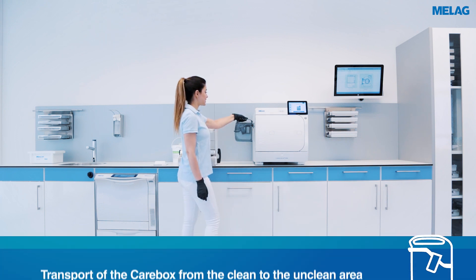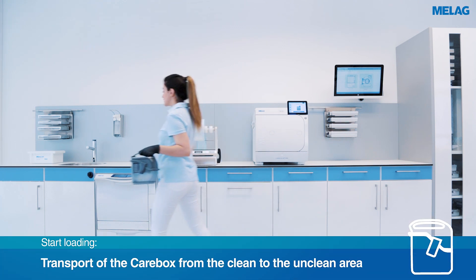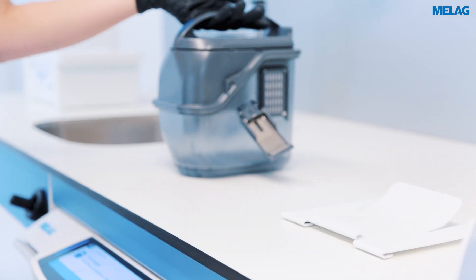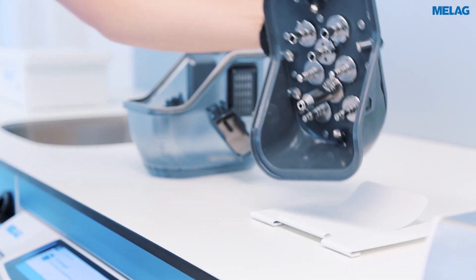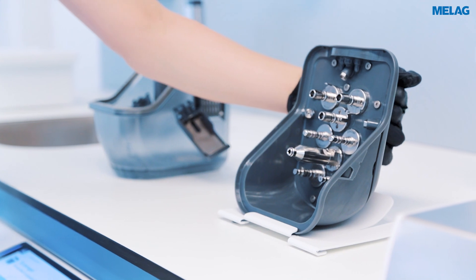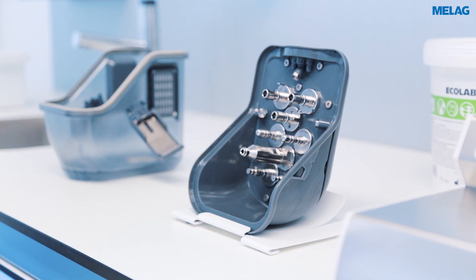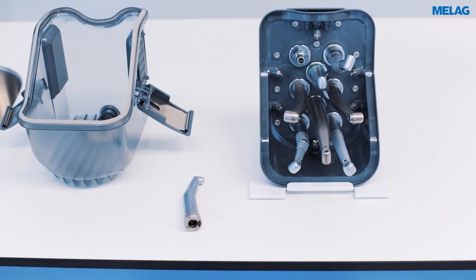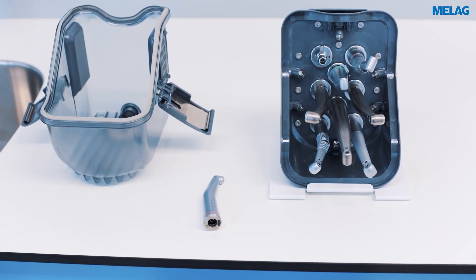The Carebox is loaded on the unclean side of the decontamination room. Up to eight hand pieces and turbines can be cleaned, disinfected and lubricated in Carebox blue with corresponding adapters. Thanks to the innovative dosage system, even adapters that you do not need can be kept free.